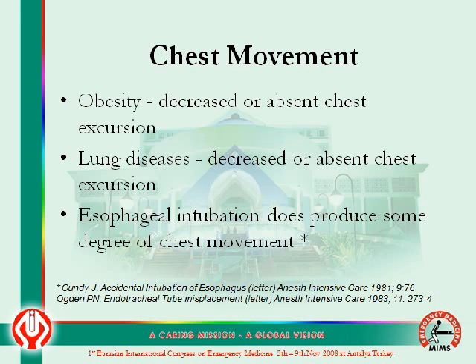What about chest movements? Conventionally, we look at the chest movement to confirm the tube position, but sometimes in situations like obesity and lung diseases, the chest movements are either decreased or absent. And even sometimes an esophageal intubation does produce some degree of chest movement.